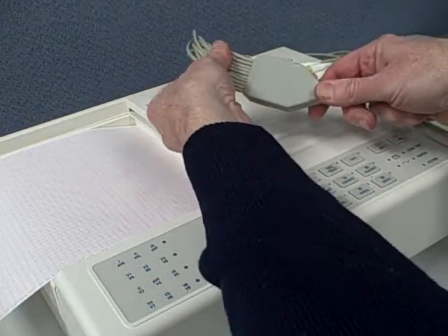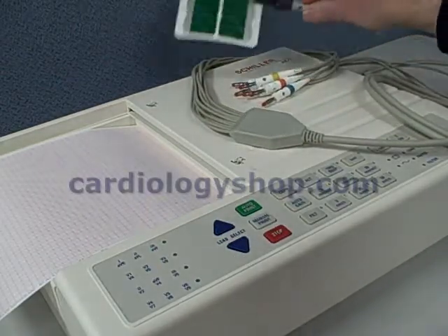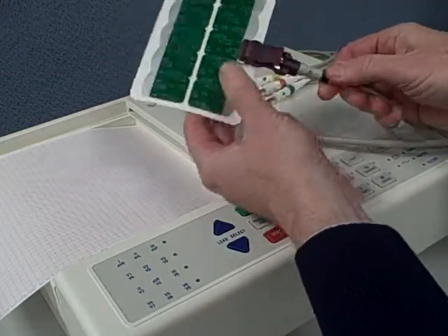It's got a nice strong cabling system, one-piece construction, and clip adapters on the end for tab electrodes. A pretty standard setup there.